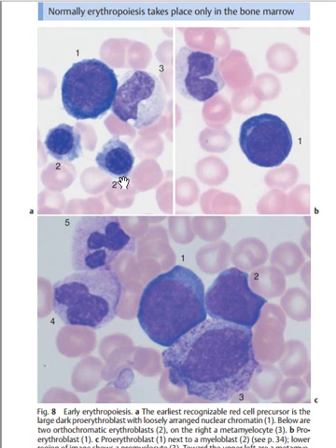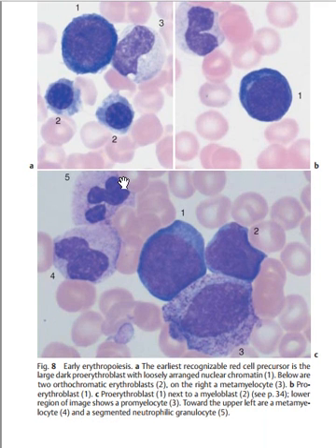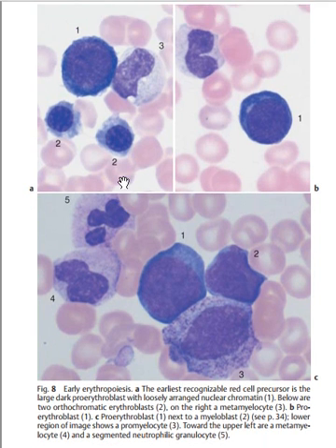On this blood section, what you visualize is actually early erythropoiesis. This is a diagram of early erythropoiesis. In diagram A, we have the earliest recognizable red cell precursors. Is it clear? The earliest recognizable red cell precursors are called the pro-erythroblasts, and they are shown in diagram 1.